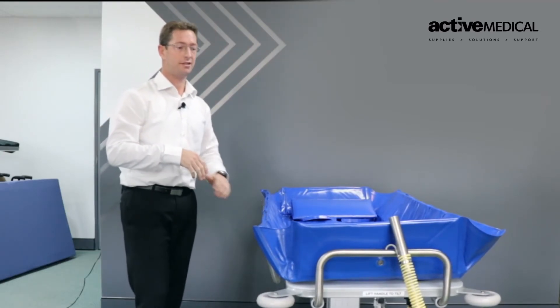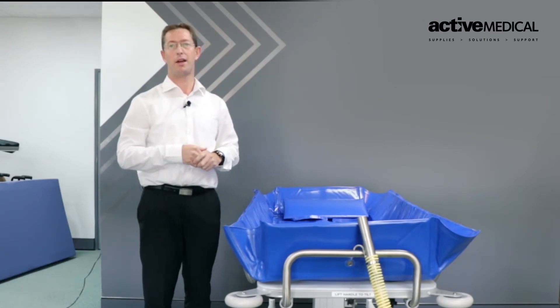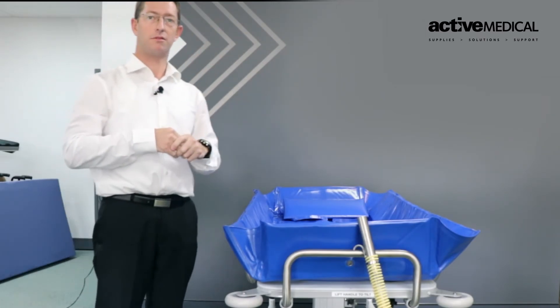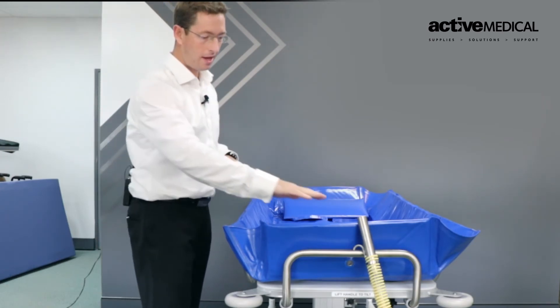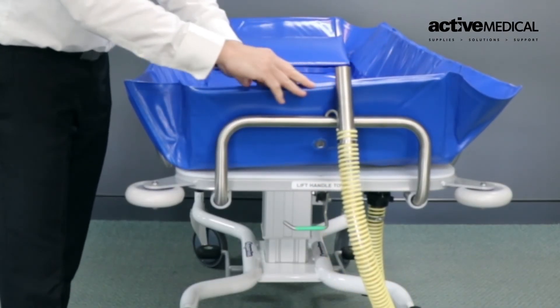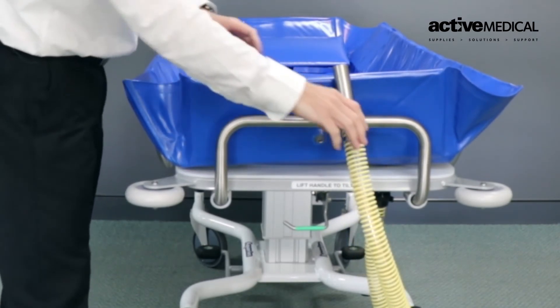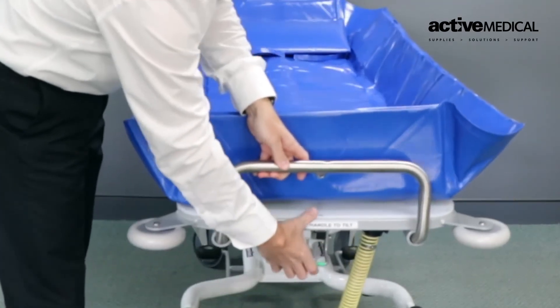Here we can see the hose at the end, which determines the difference between having a bath or having water freely running over the body. If the patient requires a soak in the shower trolley or a proper bath, ensure the hose is attached to the end rail and sitting above the liner. For a shower with water running over the body, we can take it down to the drain and lower the trolley down.